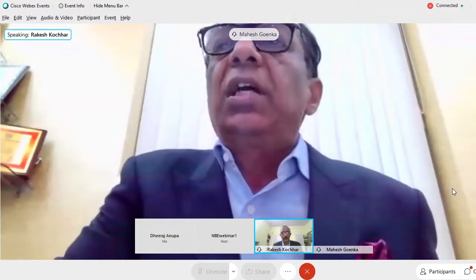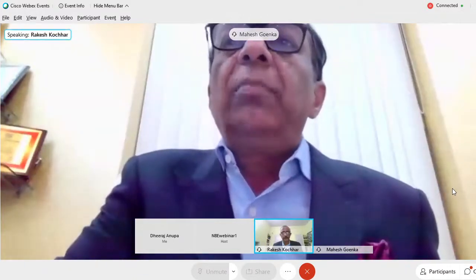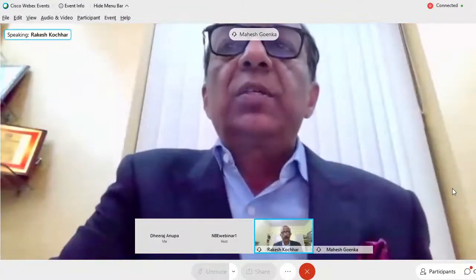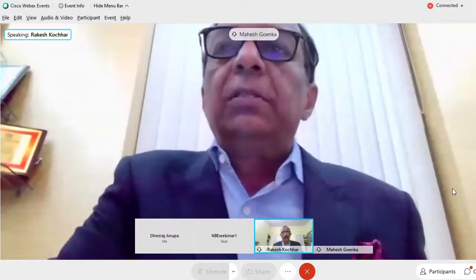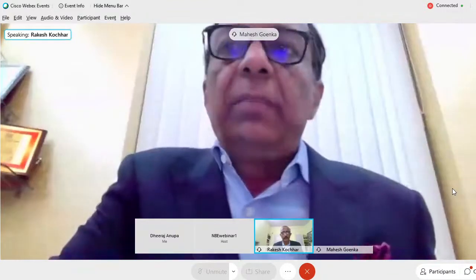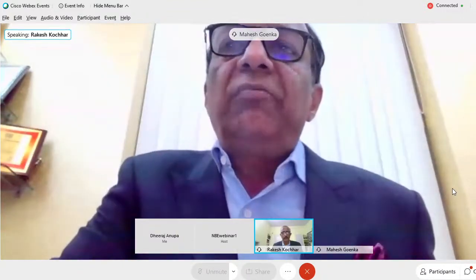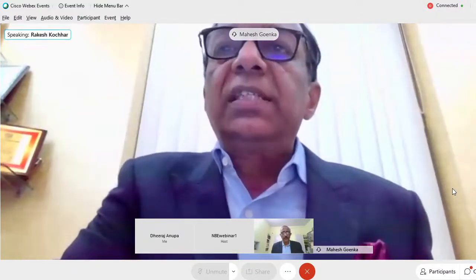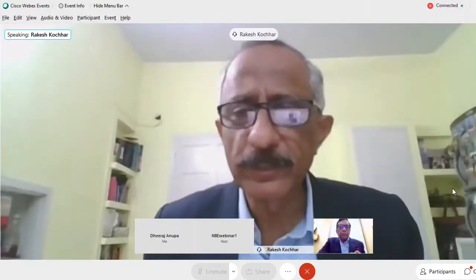So I think this is something which you have highlighted, and which is that normally in a hurry we just enter second part of duodenum and come out. So I think we should spend some time going as deep as possible because sometimes though rare, there may be a lesion in the distal D2 or D3, D4 which can be easily picked up by extended upper GI endoscopy. So this is major. Yes, sir.